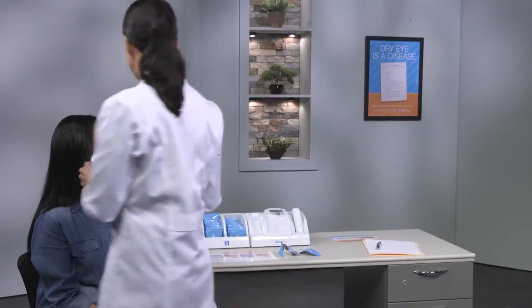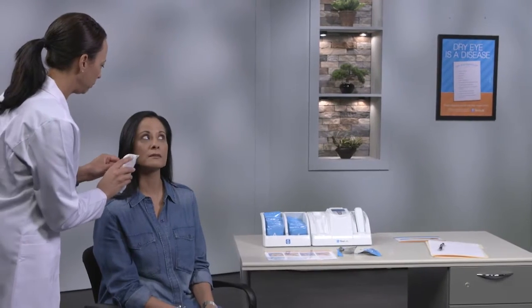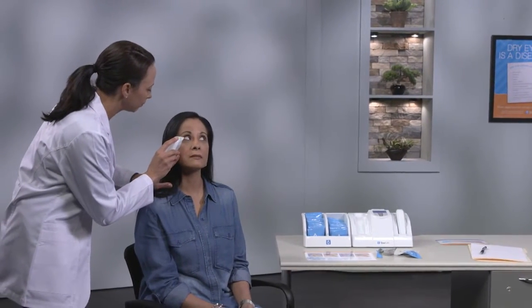As a reminder, when a patient has very little tear fluid, the collection can be more difficult as the tear meniscus may actually be below the margin of the eyelid.